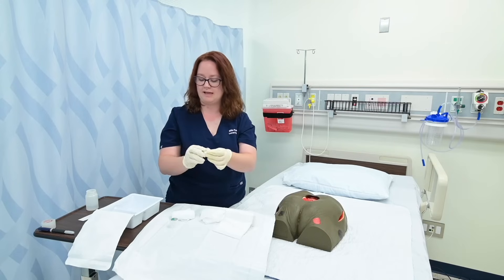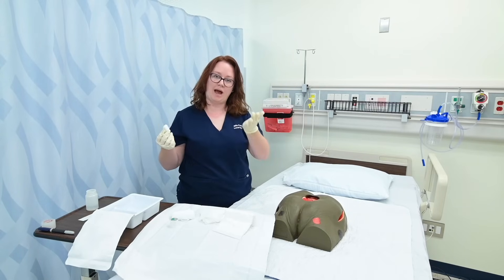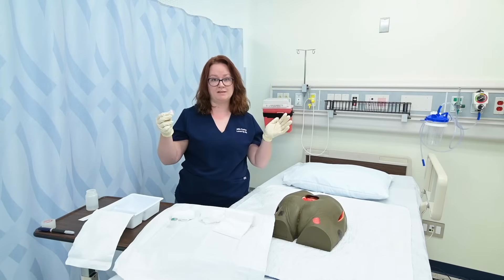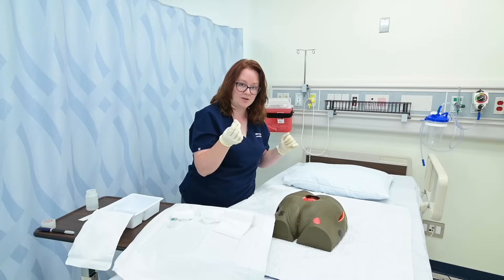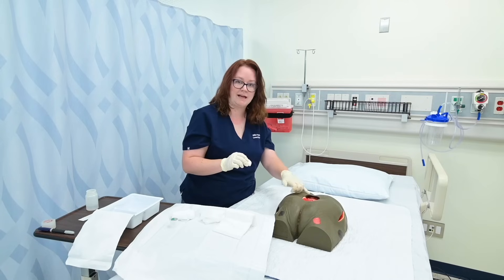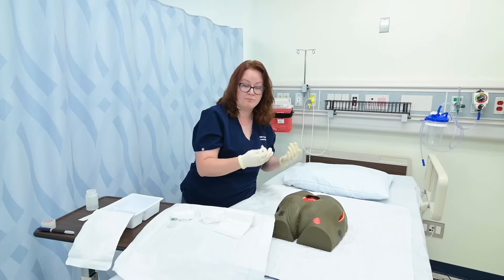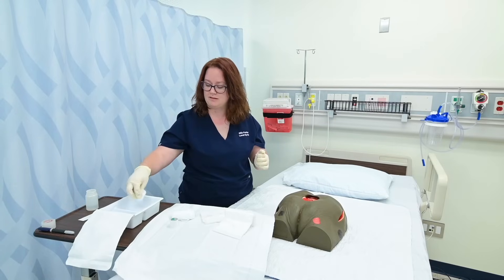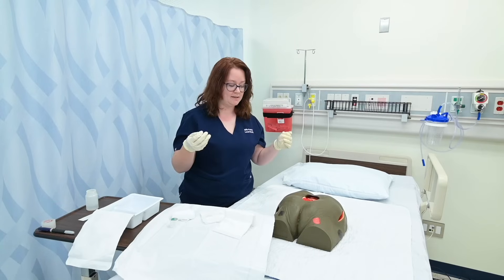I'm going to dip some of my gauze in the saline itself. When I clean my wound, I'm going to start at the center of the wound and go out towards the edges, and each swipe will need a new piece of gauze. I need to start at the center and go out because if I started on the outside edge and pulled in, I'm taking any bacteria that's outside of that wound bed and dragging it into the wound — potentially contaminating it further. So I start on the inside, go out, discard, get a new piece, dip it in saline, start on the inside, come out, and discard. I would continue that process until my wound was clean.